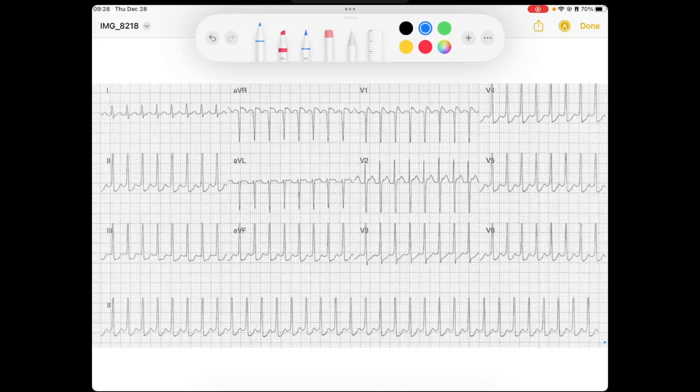Welcome back to this week's EKG. Let's get started. The first thing I'd like to do is take a look at the forest and the trees — the forest being the QRS complexes. I started by looking at the rhythm strip down here in lead II.